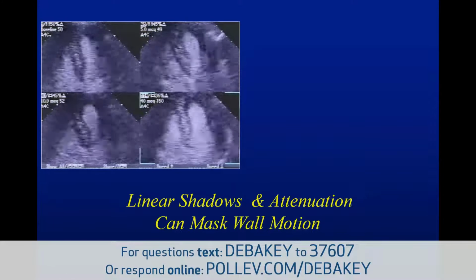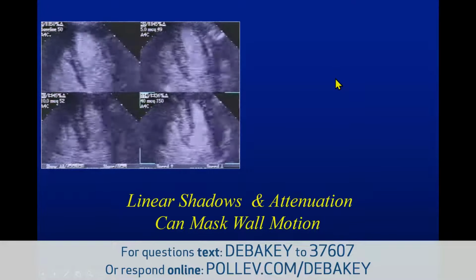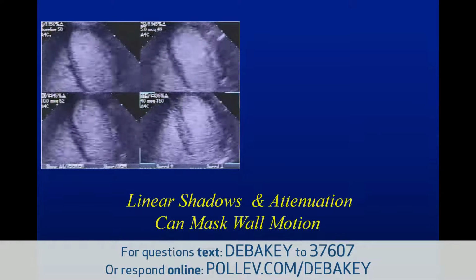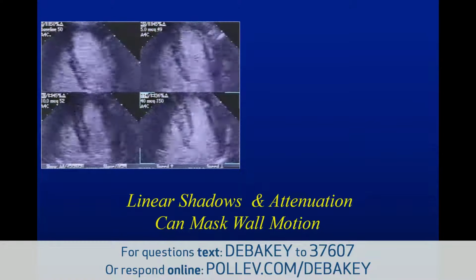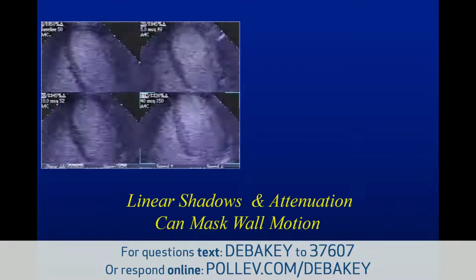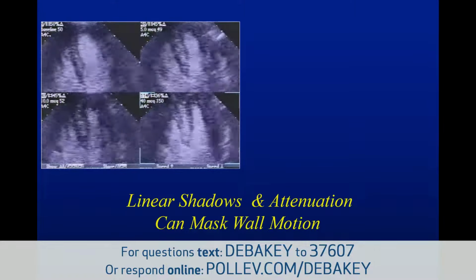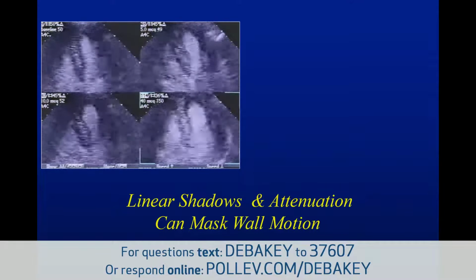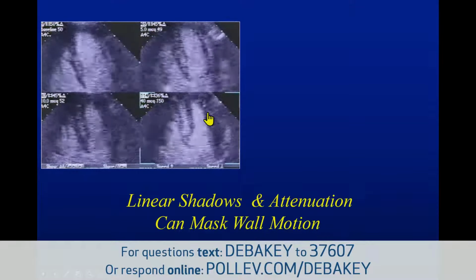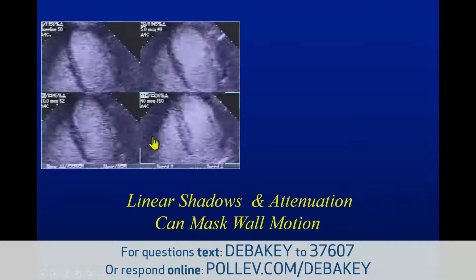A few cautions when you use contrast. The first caution I would say is, if you have really pristine images in the views that you want to get, you don't need to use contrast. Realistically, in our laboratory we use contrast about 70 or 80% of the time, depending on the initial quality of the echocardiogram. The reason is you may have some decrement in the quality if you start with pristine, beautiful, excellent quality images. And also there are some artifacts and shadows that you need to be careful of, and this is an example of such.